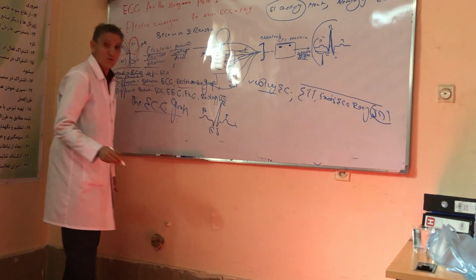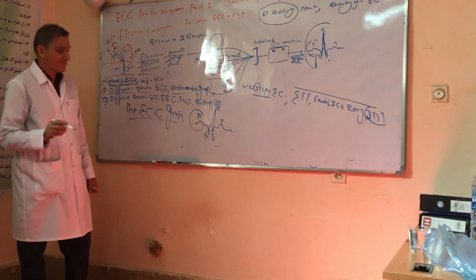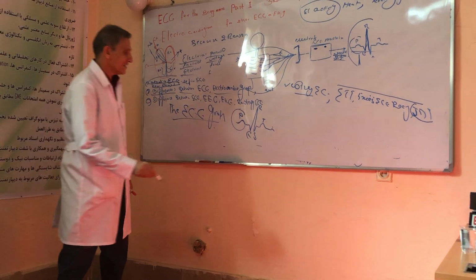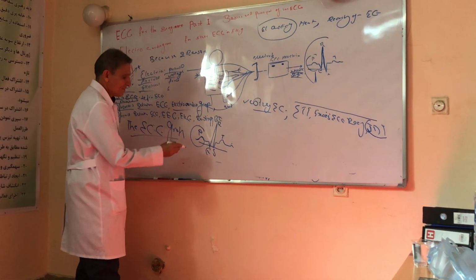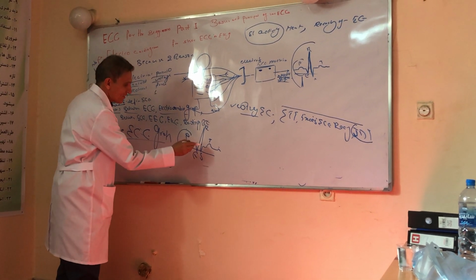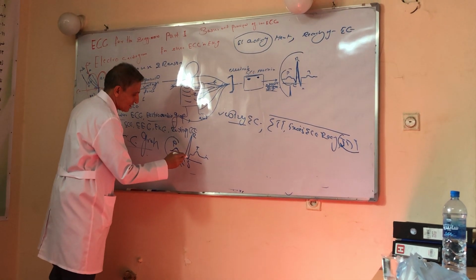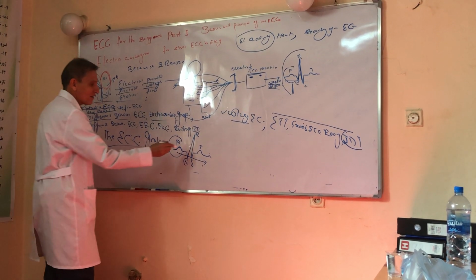And the U wave. Those waves are deflections. For example, this is deflected here and this. Those waves and deflections which are seen during one cardiac cycle are called the ECG graph. ECG graph is the representation of one cardiac cycle, P, Q, R, S, T. A series of waves or deflections is called the ECG graph, which represents one cardiac cycle.